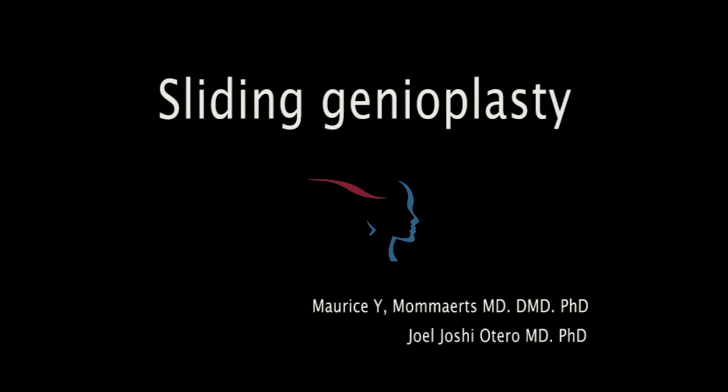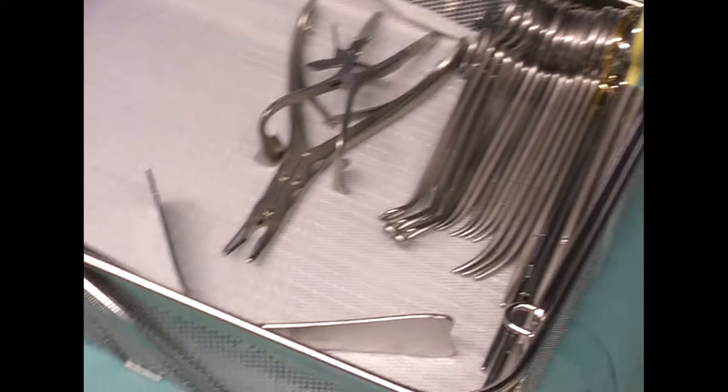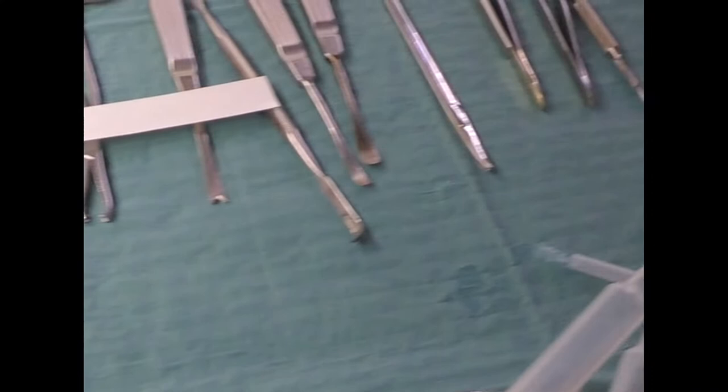Hi, this is Maurice Maumartz and Joel Otero commenting on sliding genioplasty. We have set up different cameras so we can toggle between different views.